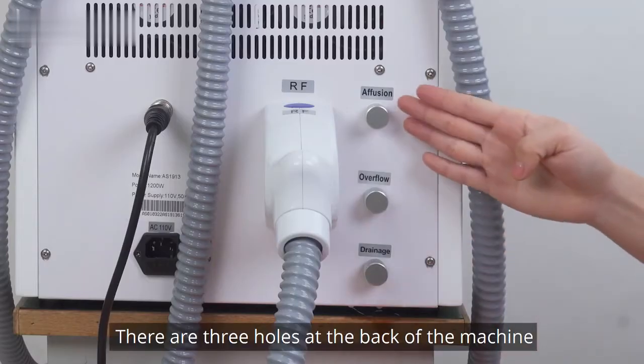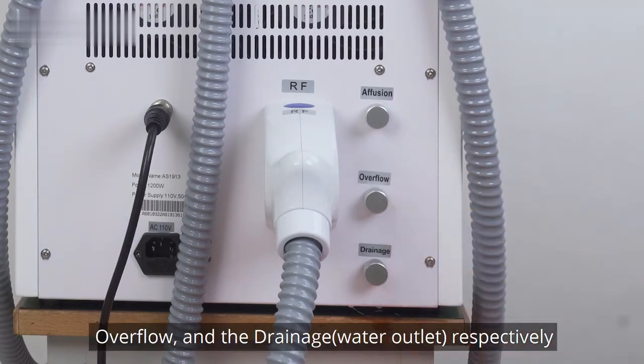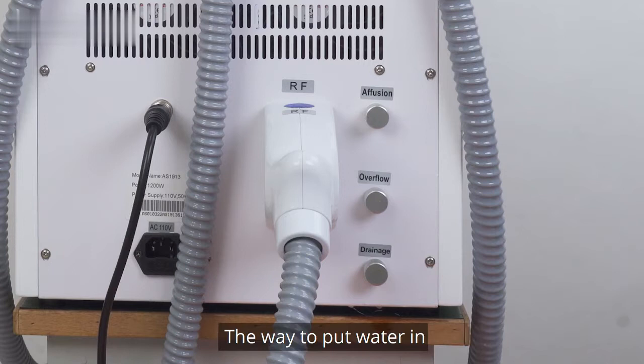There are three holes at the back of the machine: infusion, overflow, and drainage respectively. Please pour pure water or distilled water in before starting the machine.